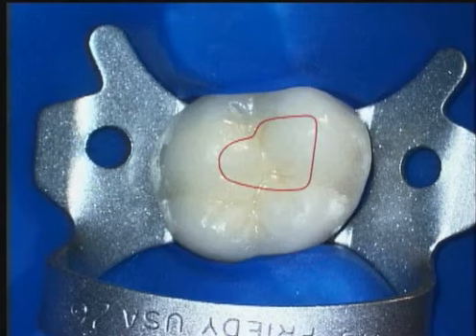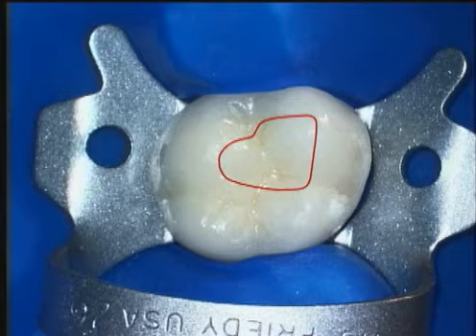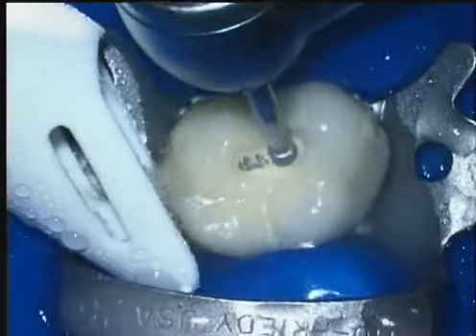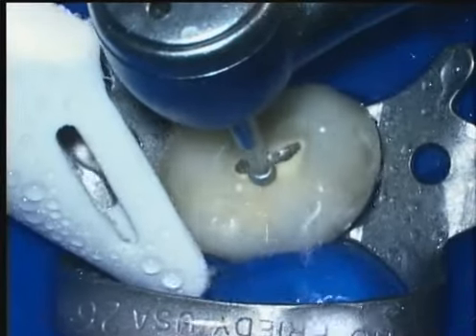The outline pattern guides our clinical actions, but in a maxillary first molar we need to be aware of the presence of an MB2, which is present clinically over 90% of the time. Therefore, the access cavity needs to be expanded at the expense of the mesial marginal ridge. A number 4 round burr diamond with voluminous amounts of water helps us make a safe window through the porcelain.